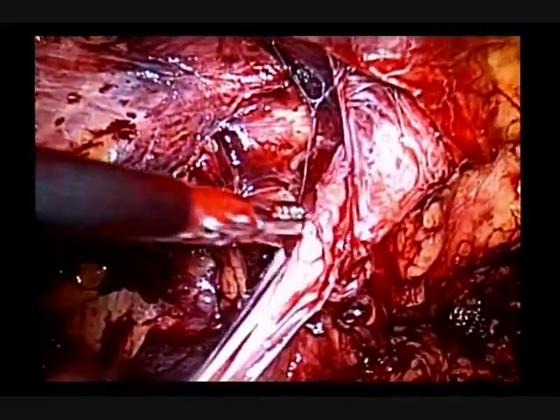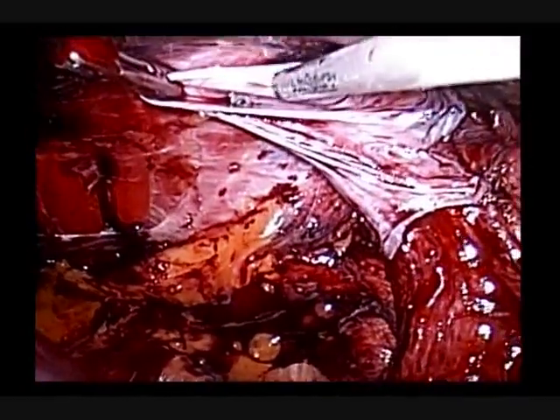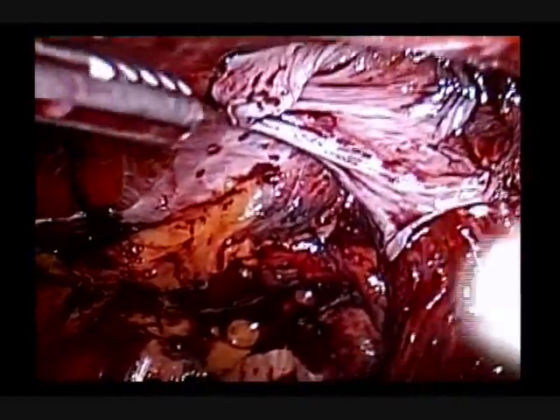To avoid seroma, we carefully retract the distal sac. A full 6 by 4 inch mesh is deployed, spread out and fixed with tackers.